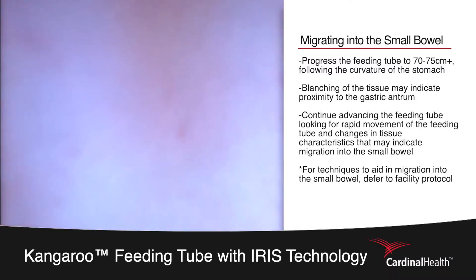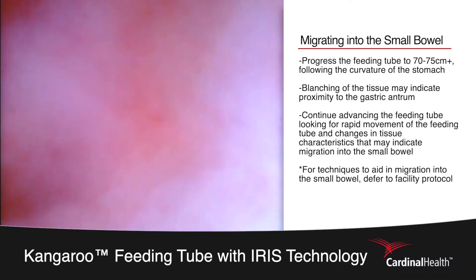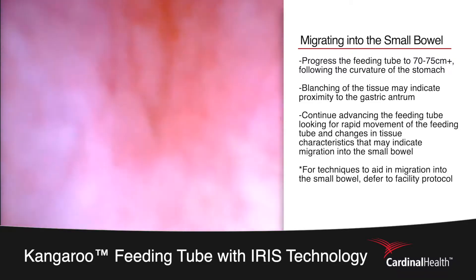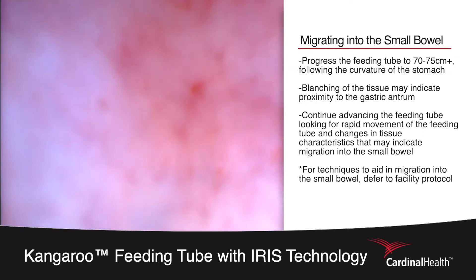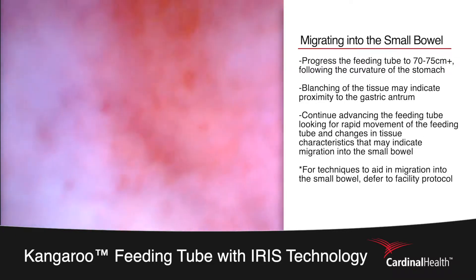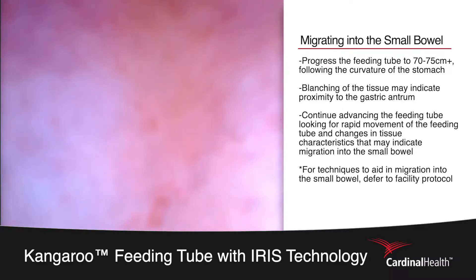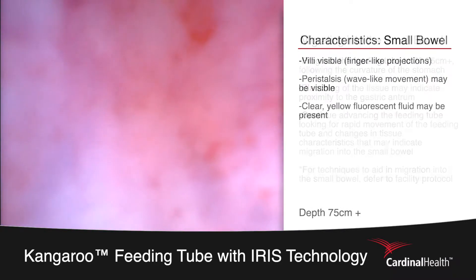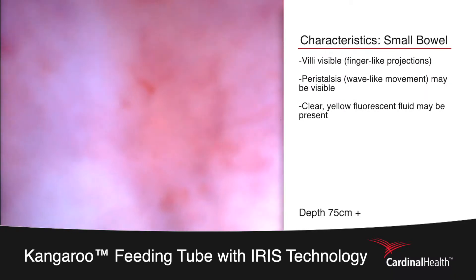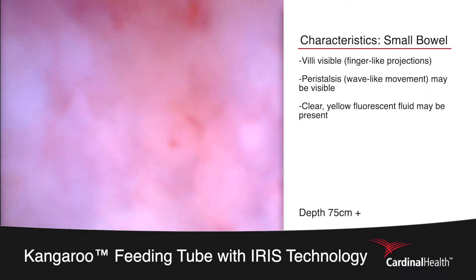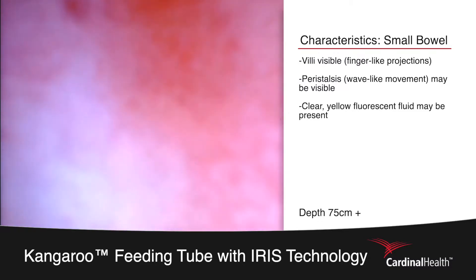In this patient, we're able to visualize the pylorus open and close as the tube progresses through it. After visualizing rapid movement around the 70-75 centimeter mark, we're looking for changes in the tissue to determine that we've progressed into the small bowel. The tissue of the small bowel is covered with finger-like projections called villi that will move around the feeding tube in a wave-like fashion.